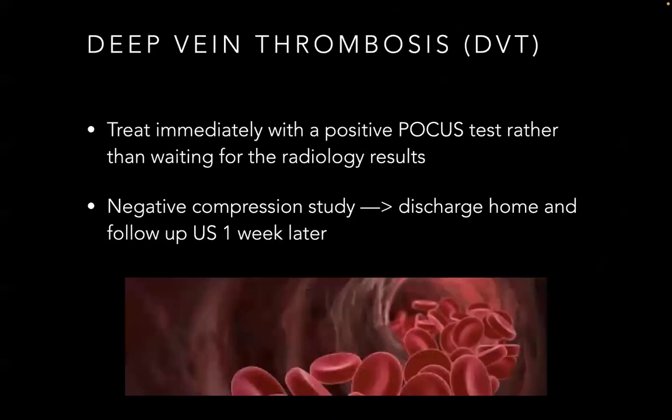And so with a positive POCUS scan, you could treat immediately rather than waiting for the radiology results. And if there's a negative bedside compression study, you can still get a radiology ultrasound within 1 week if there's high enough probability.